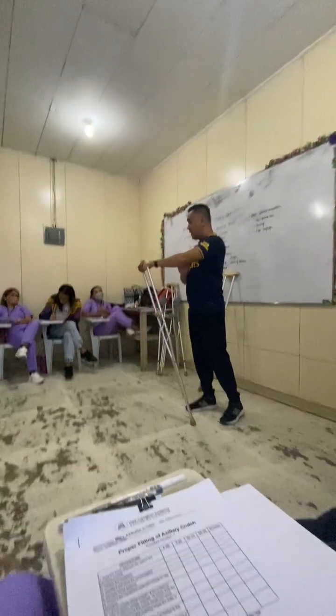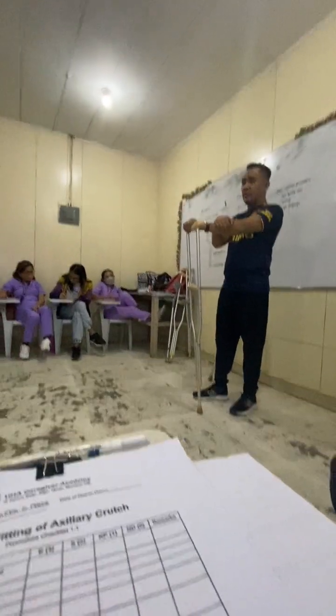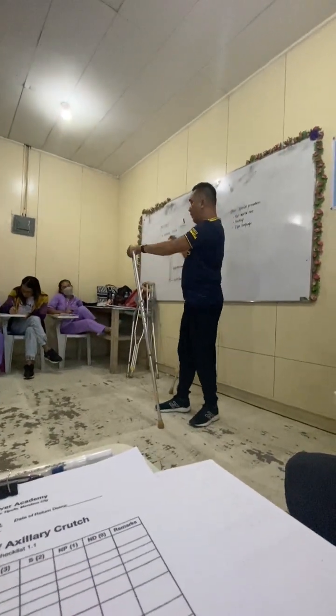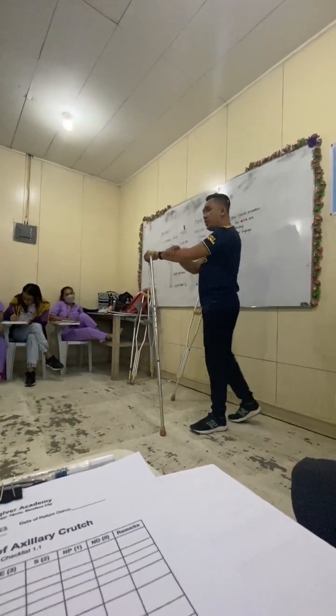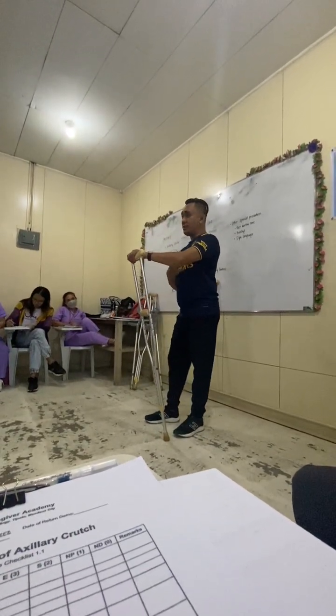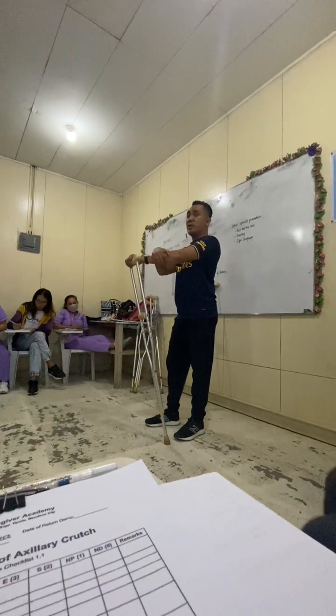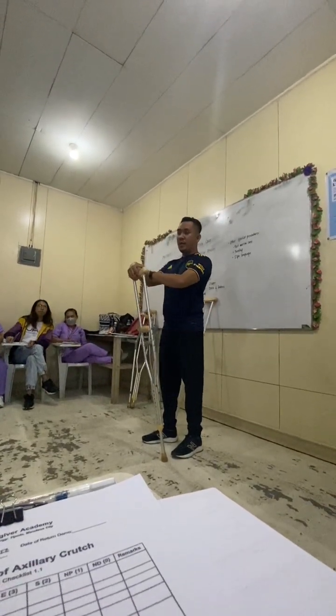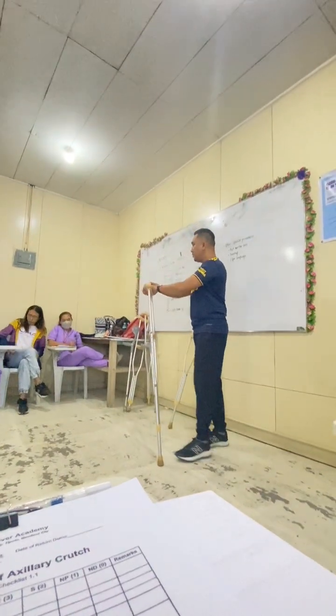Hospital settings na siya, and you will be guiding your patient in walking. Okay, so you have to enter the room by knocking on the door, approach your patient, and then you have to introduce yourself. Okay, hi ma'am, hi sir, ako ni si Prince, imong caregiver karon. Kamusta man ka? Things like that.